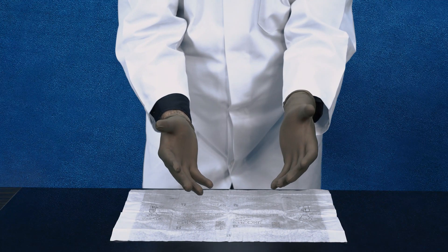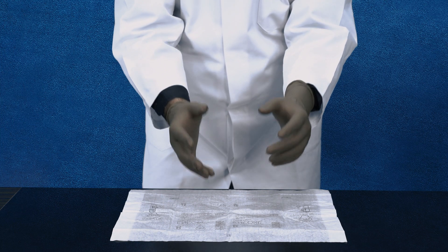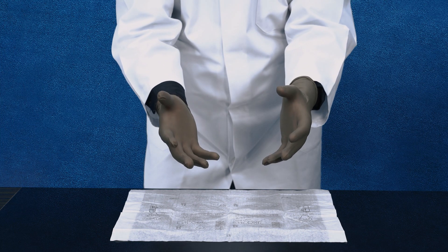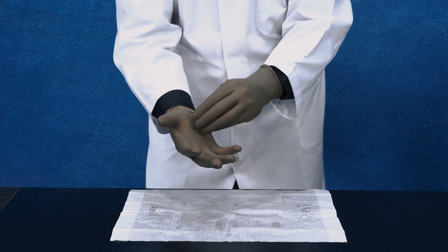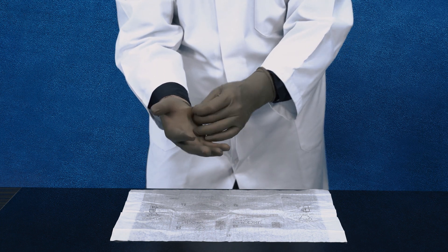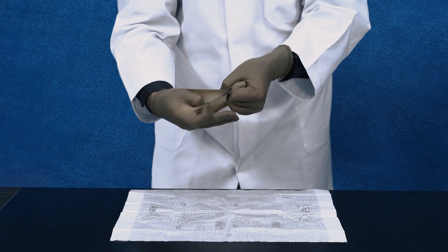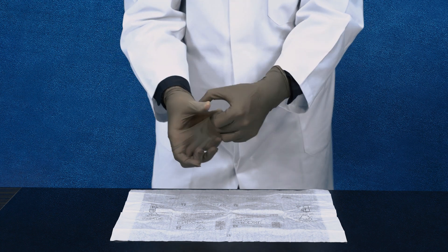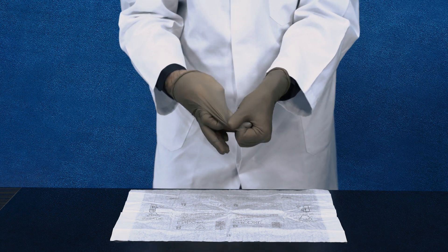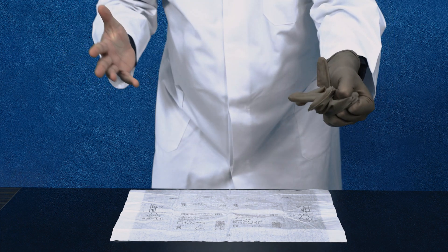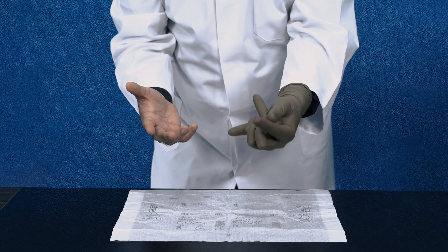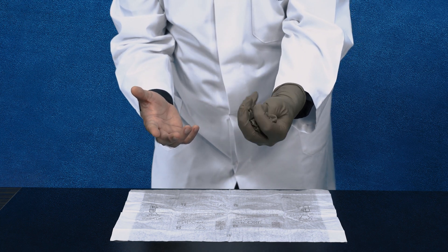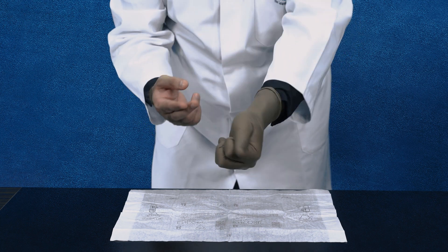Do a fantastic surgery. Now when you have to take out your gloves, this is important. Your hands can touch only this area. So you will hold the gloves and then you will slide them out without touching the inner side of the hand. Your hand is free now.